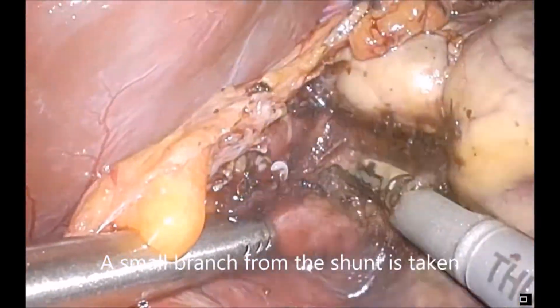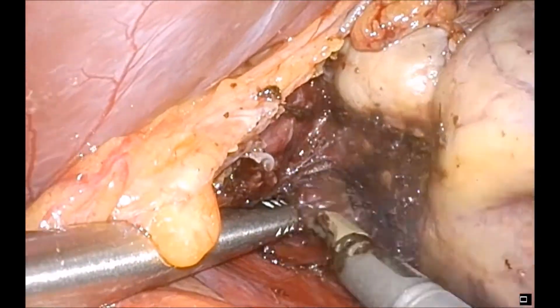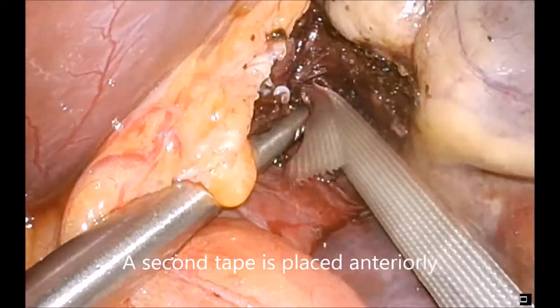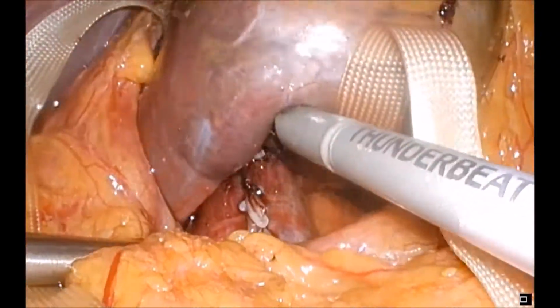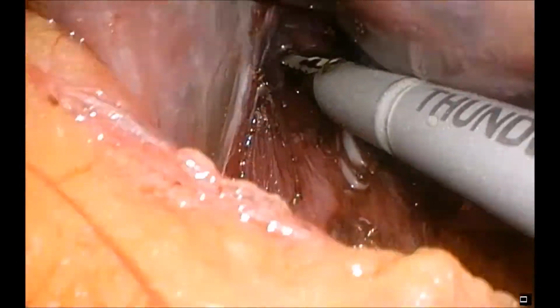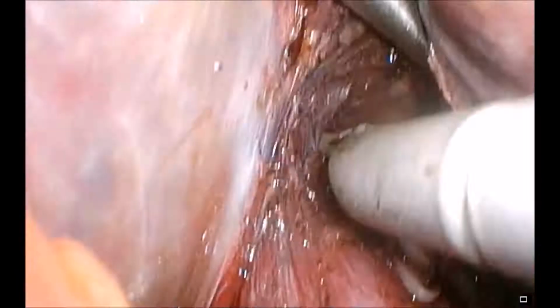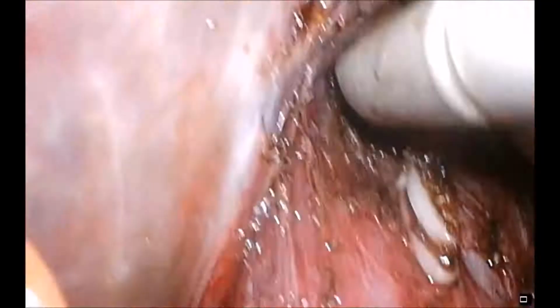Another small branch from the shunt to the caudate lobe is taken down to elongate the shunt, and now some tape is placed anteriorly to see whether we can see that from the posterior aspect. The previous tapes popped out and further dissection continues. It helps us to see how far we have to go.